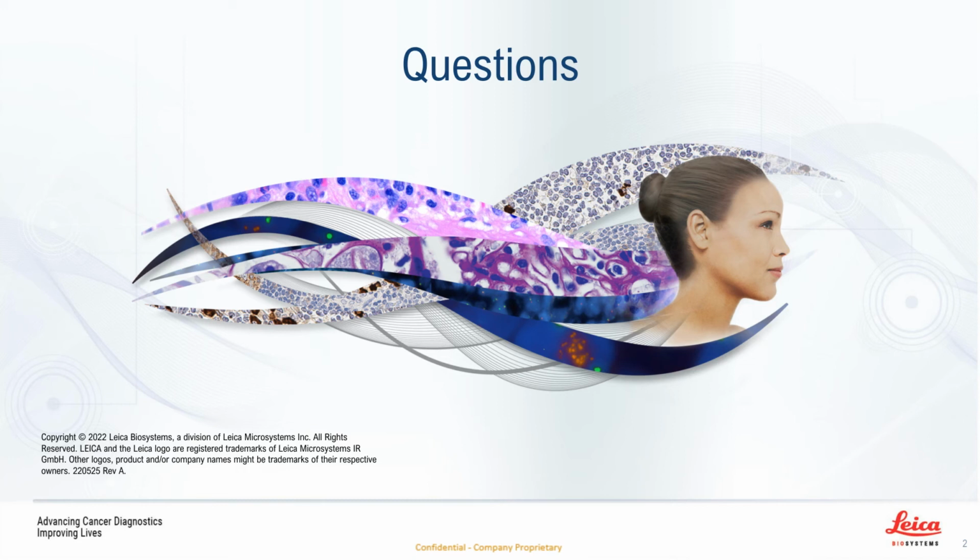I think what you would need to do though is be really careful at microtomy and the floating stage when you're putting your samples on the slide, to make sure that they are not only inside the boundaries of your cover slip, but also inside the boundaries of the scan region for the scanner that you would be using.